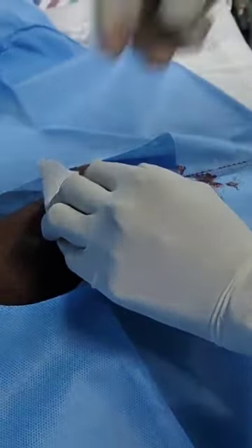Then you have to remove the needle. Then you have to put this.